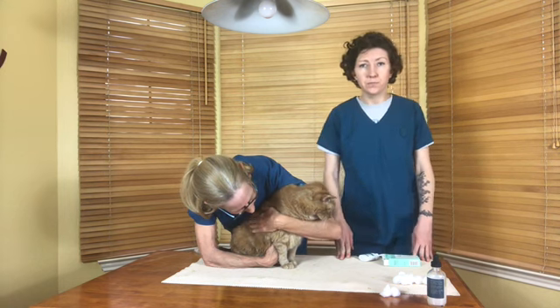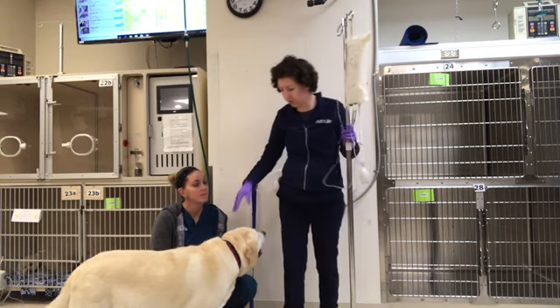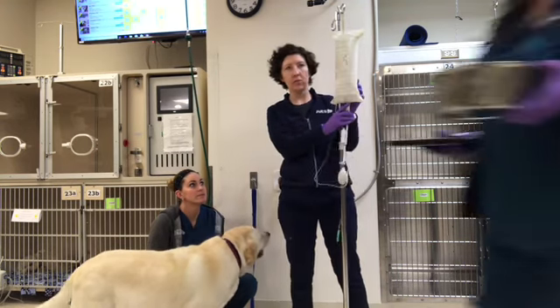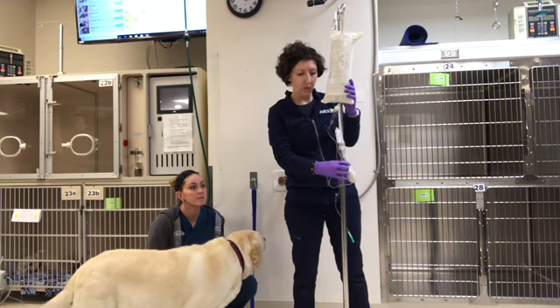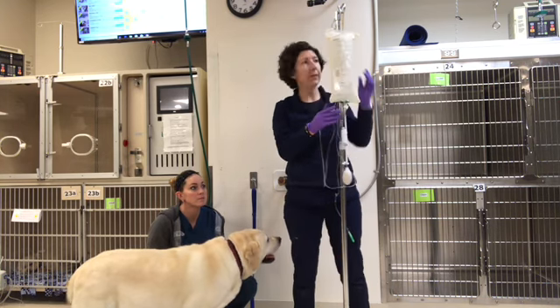Okay, so today we're going to do sub-Q fluids into this guy Ben here. We're going to do 800 milliliters of lactated ringers. So I've got my bag of lactated ringers here in this slam bag, and this is a bag where we can pump it up so it delivers the fluids quickly.